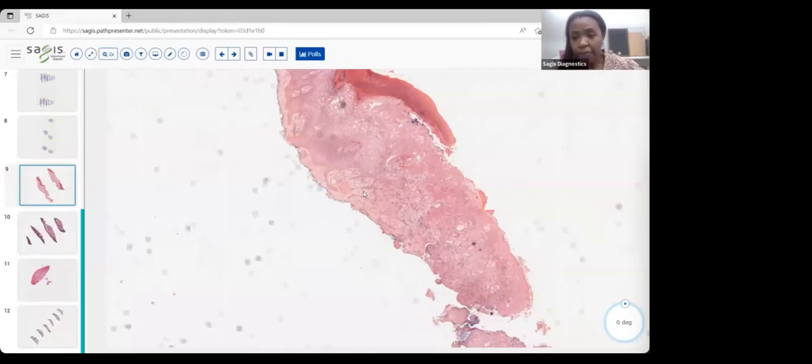histology. And then the intracytoplasmic inclusions in the keratinocytes, they're also somewhat characteristic. They tend to squash on the nucleus a little bit. They tend to push against the nucleus. That's where you find them, as somewhat perinuclear. They're very eosinophilic too. They have a name. They're called Guarnieri bodies, right? So the Guarnieri bodies are described in that group of pox viruses, smallpox and monkeypox, and that's the name given to them. Okay, so now moving along.